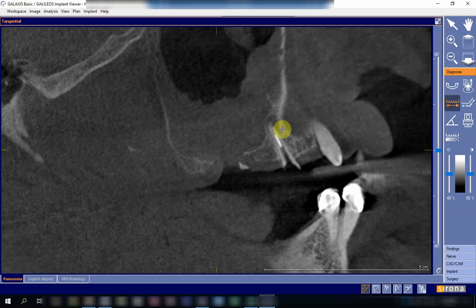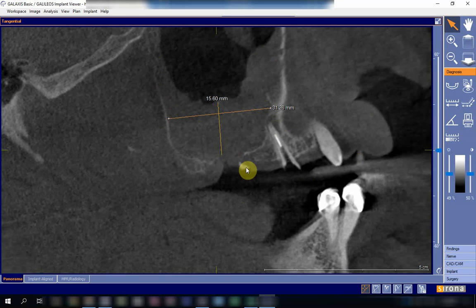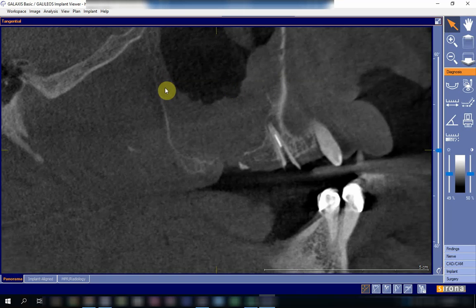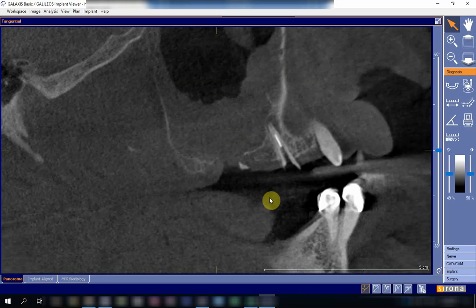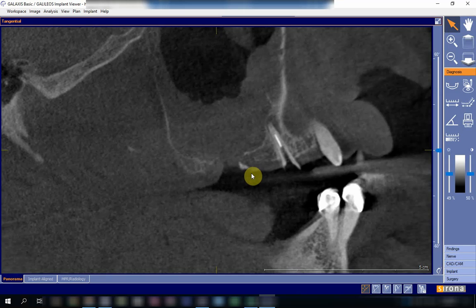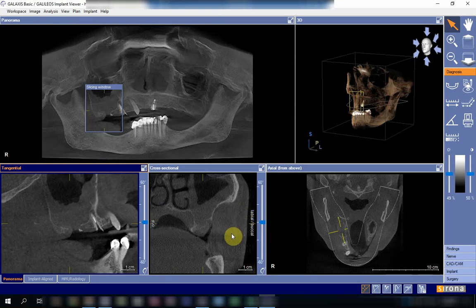There is a grayish area that measures around 15 millimeters in height and extends all over the floor of the maxillary sinus. This is not fluid — fluid would appear horizontal. This represents granulation tissue or thickening of the mucosal lining of the floor of the maxillary sinus in response to the oral antral communication. This appears to have been present for a long time, or was recently aggravated by the effect of the communication between the maxillary sinus and the oral cavity.